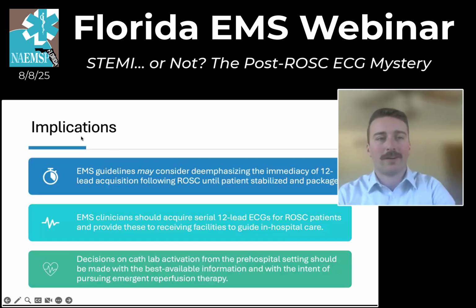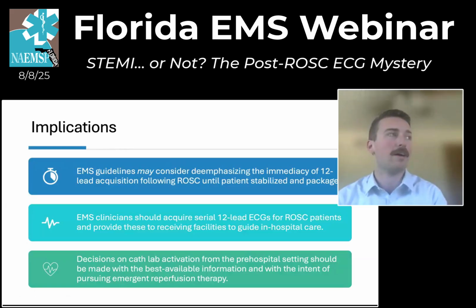So let's talk implications, because I think that's what a lot of people in EMS are really interested about. And this paper brings up some interesting questions. Certainly the timing of an EKG following ROSC is a large one. It is important that we need to get EKGs to really guide our care in the pre-hospital setting. But there are a lot of other things that need to happen for patient care in the immediate ROSC period. And perhaps we can delay the acquisition of that immediate 12 lead in favor of really making sure that we have optimized our patient care.